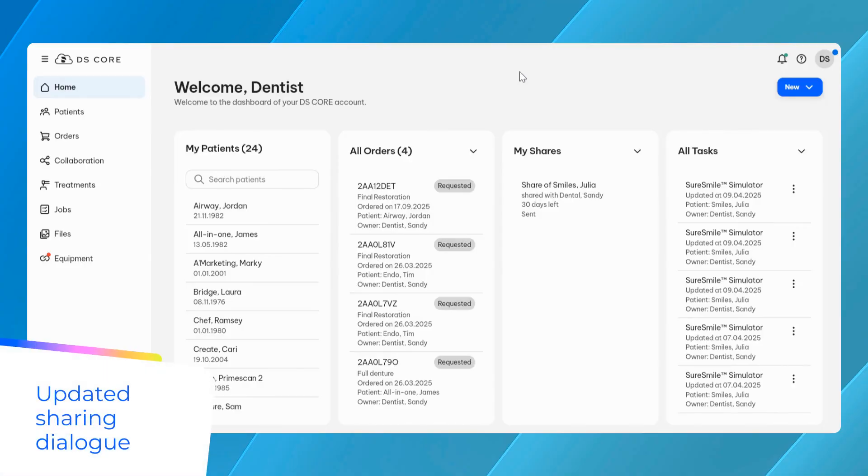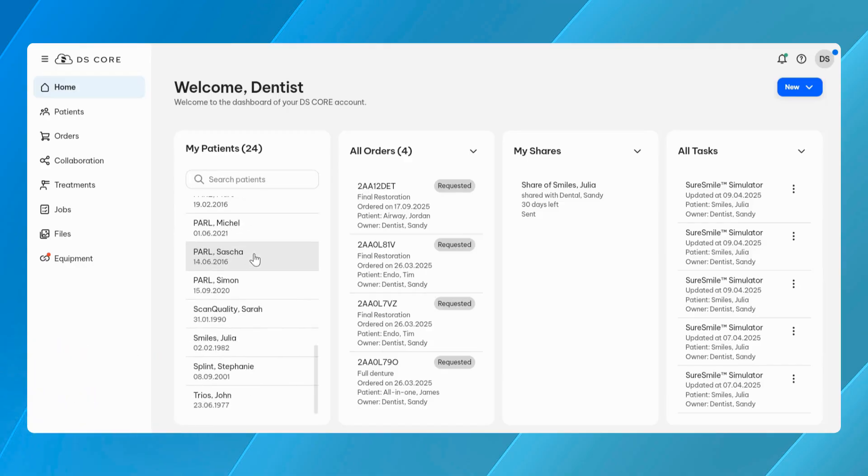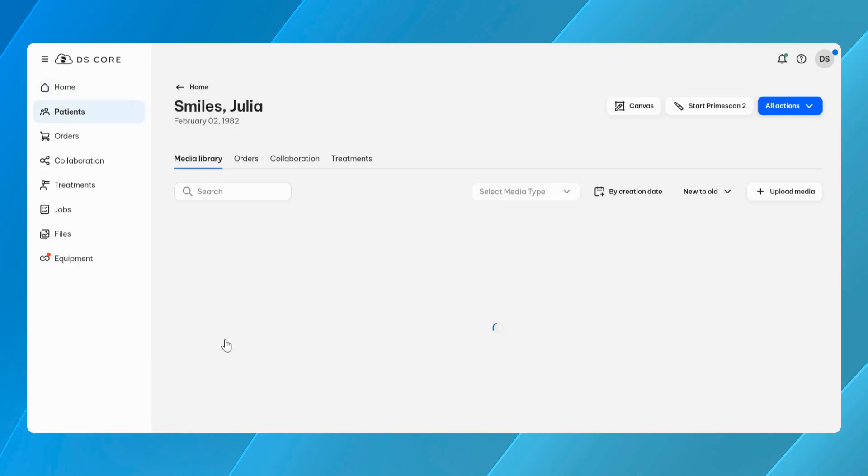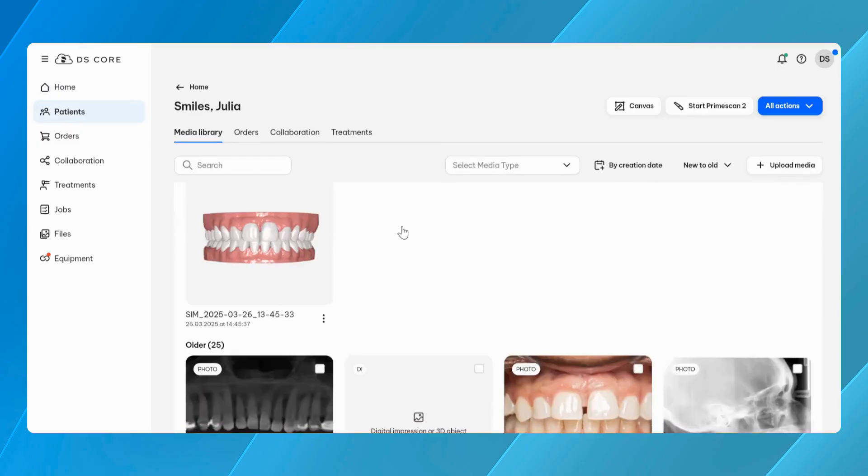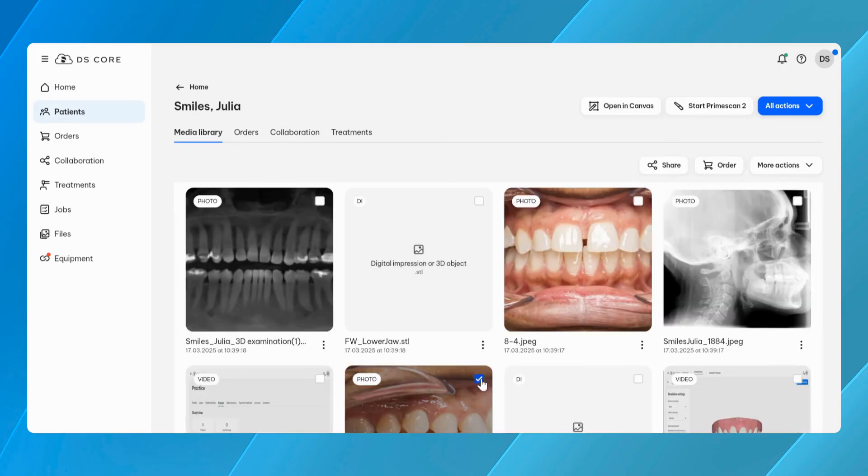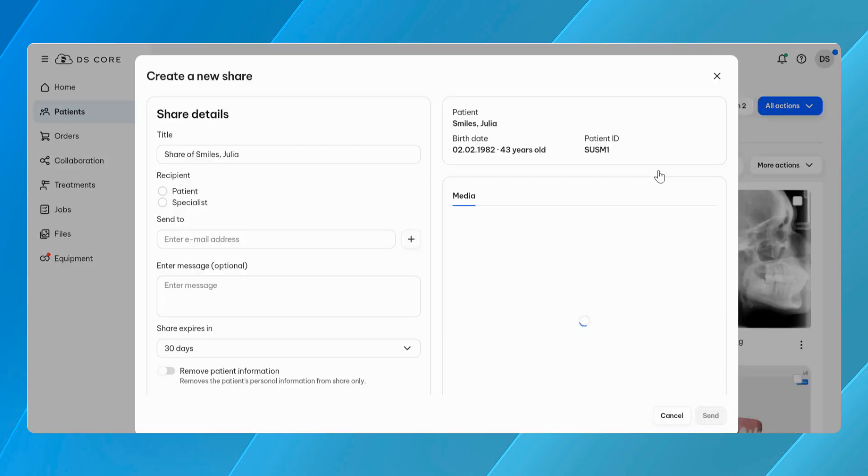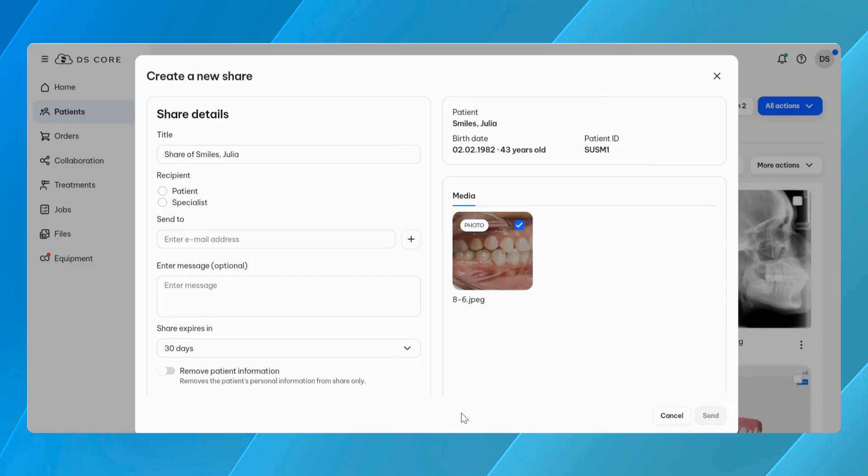Collaboration across roles and specialties is a key part of modern dental care. To support this, DS-Core introduces a redesigned sharing dialogue that makes it easier to share patient data supporting secure and flexible handling. Previously, sharing from the Media Library was located on the right-hand side of the screen. It has now been replaced with a central pop-up menu, providing a clearer and more consistent experience.